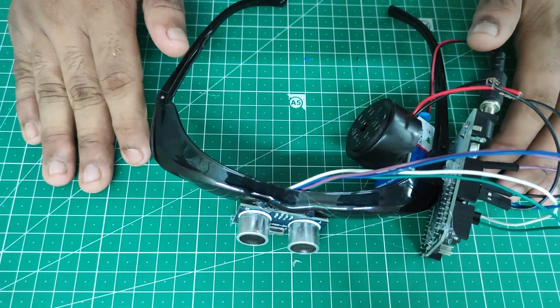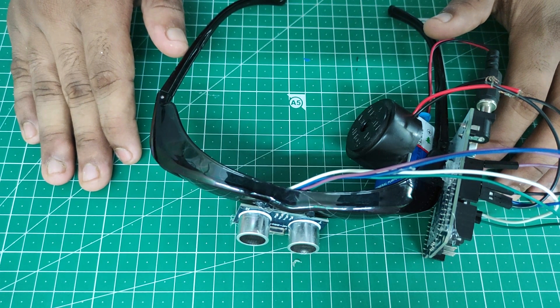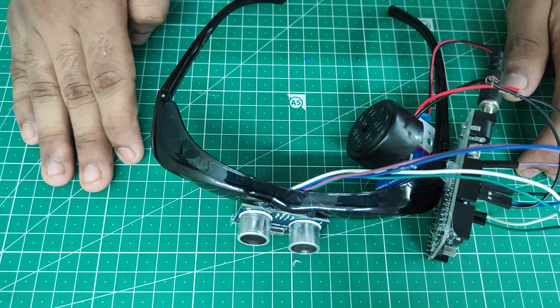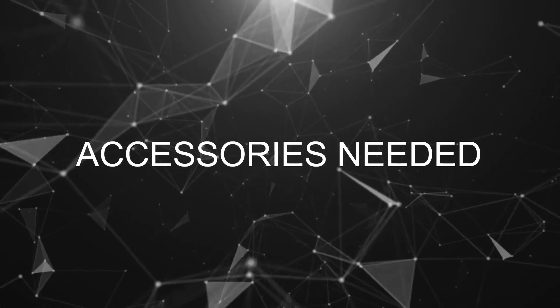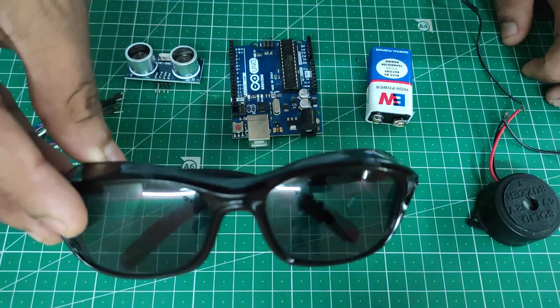Hi guys, welcome to our YouTube channel Simplified Invention. In this video we are going to make a smart blind glass for blind people by using an ordinary Arduino Uno motherboard. Let's see how to make it and what components are required. Now we will see what accessories and components are required to make a smart blind glass.